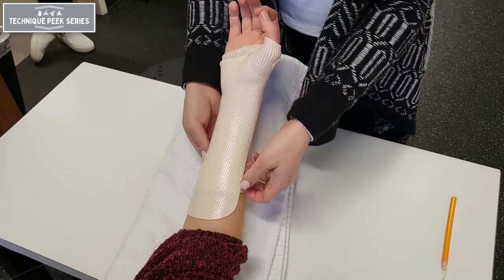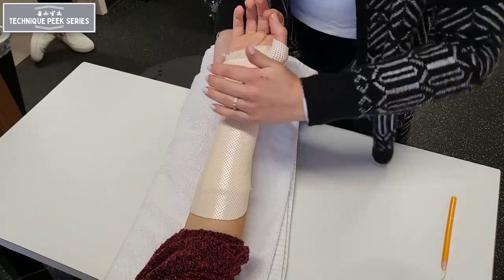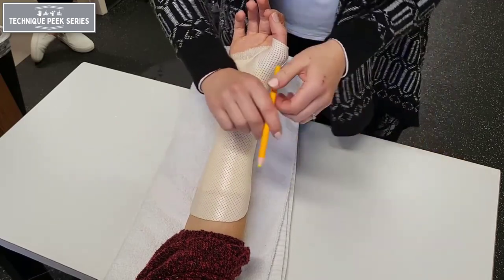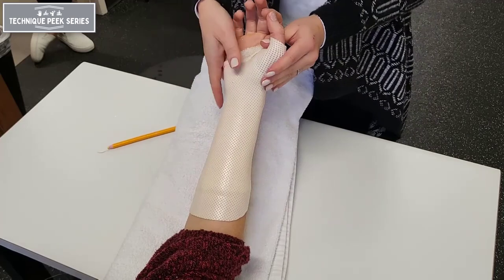Ensure that the patient is able to oppose the thumb loosely to the index finger. Rotate the thumb around to create space for the metacarpal and the IP joint to slip in and out of the splint easily. The splint is a little bit longer than two-thirds the length of the forearm, so we're going to trim that.